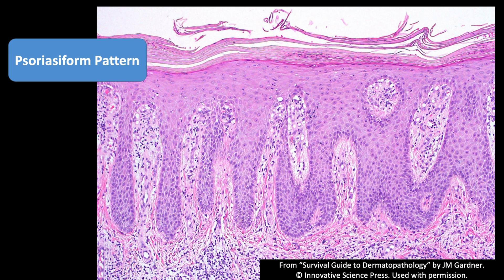The other thing psoriasis has is loss or diminishment of the granular layer. The granular layer is totally wiped out — you can barely even see it — and there's a bunch of parakeratosis, like wall to wall. If you go across the slide, almost all of the corneal layer is parakeratosis. Whereas in spongiosis, as I showed you earlier, you tend to have more patchy little foci of parakeratosis.